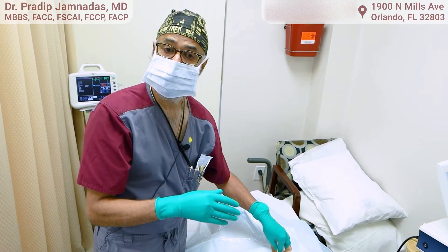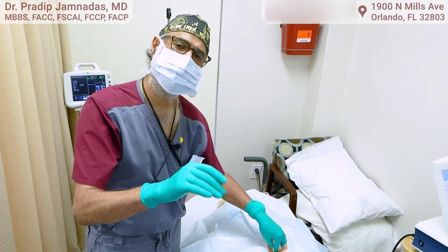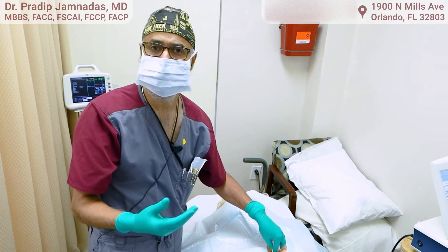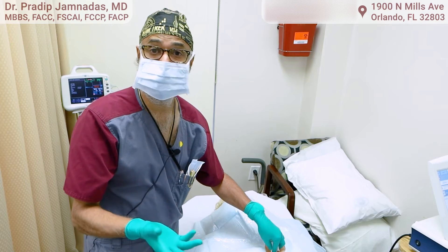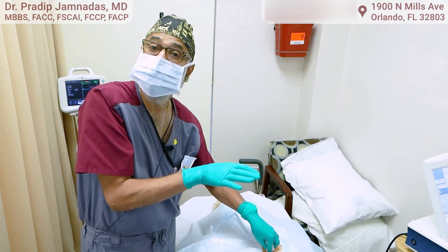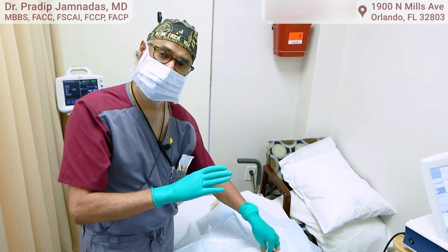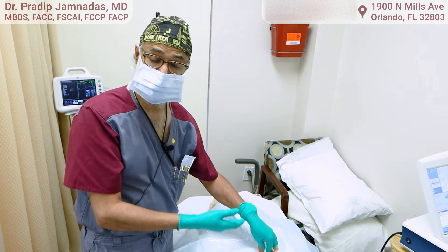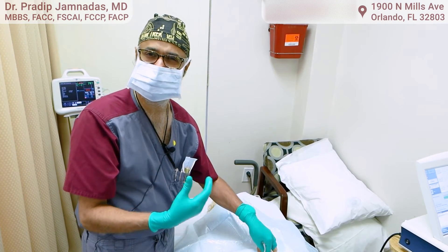Alternatively, if a patient blacks out but there are no arrhythmias, we can say they blacked out but not because of an arrhythmia, and look for other causes such as low blood pressure, low sugar levels, or even seizures. So it rules out an arrhythmia as well. This device has many applications, is totally underutilized, and we're going to use more of these implantable devices to give us physiological information on what's actually happening to the patient.